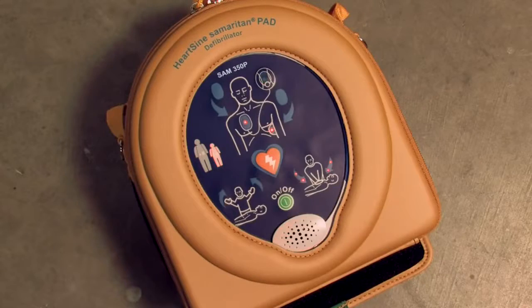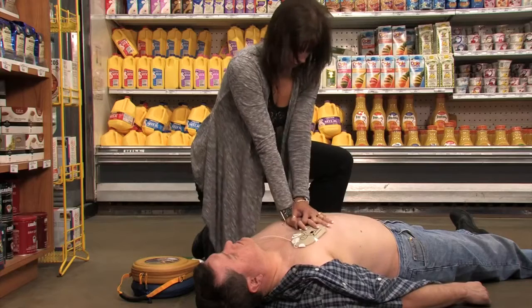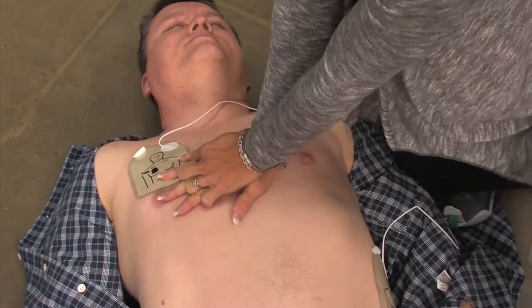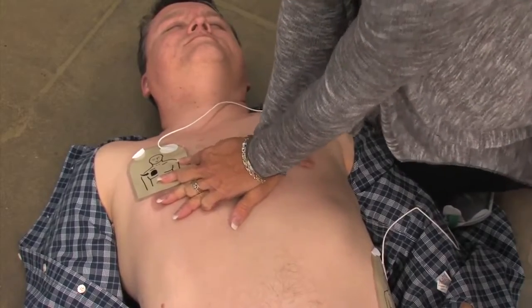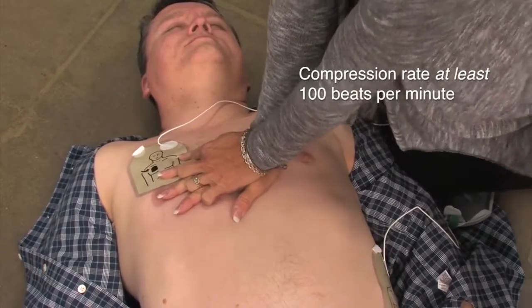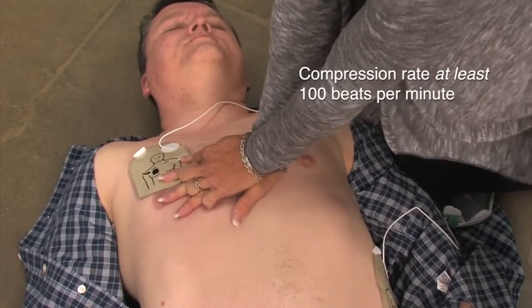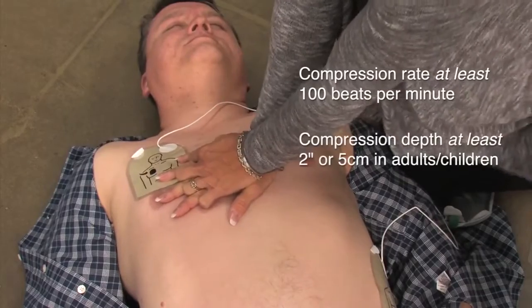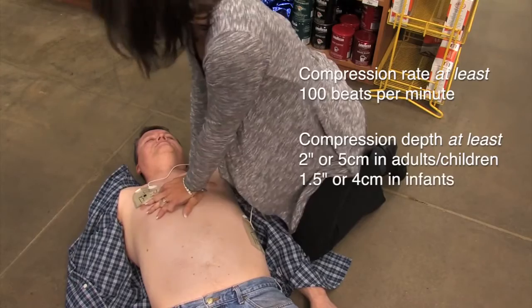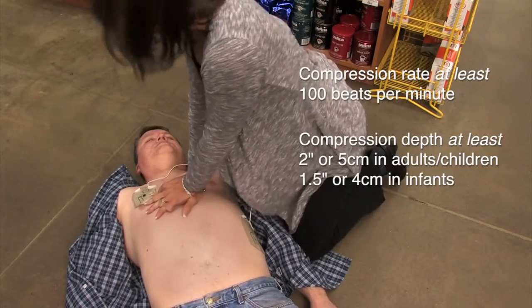The device will provide CPR coaching on how to cross your hands, where to place them, and will include a metronome beat that will coach you on how many compressions to apply per minute. The 2010 AHA guidelines for CPR and ECC emphasize the need for high quality CPR, including a compression rate of at least 100 beats per minute, a compression depth of at least 2 inches or 5 centimeters in adults and children, and approximately 1.5 inches or 4 centimeters in infants.